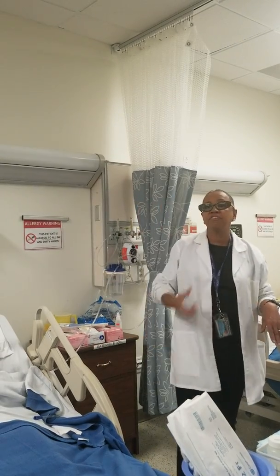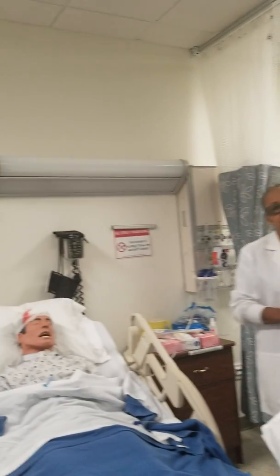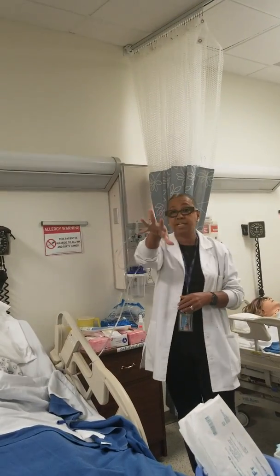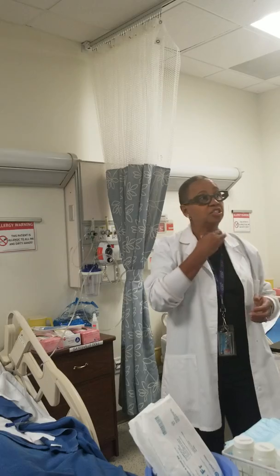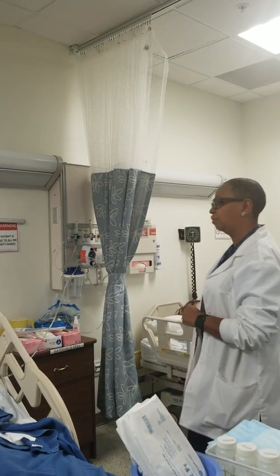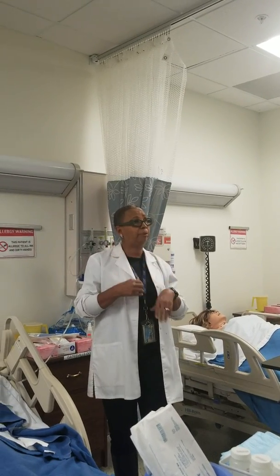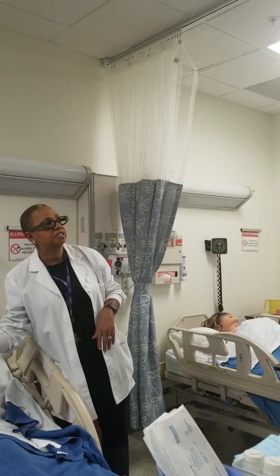Okay, he shouldn't be talking if he has a cuff trach. If he's conscious, okay? If he's talking and he's got a cuff trach, that's a problem. Because what's gonna happen is when I blow that balloon up, it's gonna compress and take away his vocal cords. He's not gonna be able to talk to you. If he's talking, or you hear air moving around, check your cuff. That means your cuff is deflated.